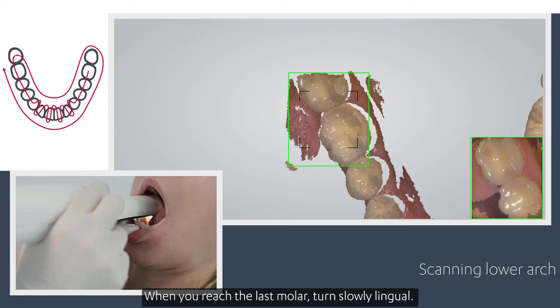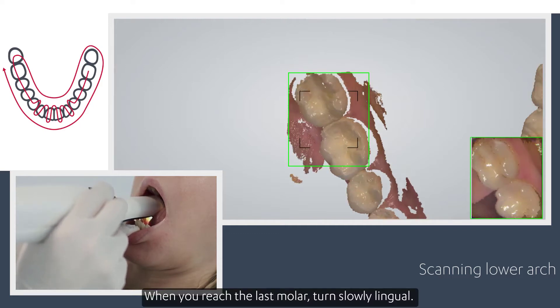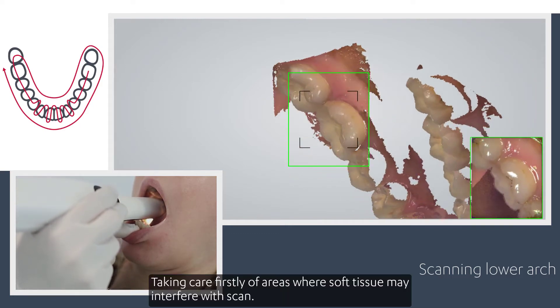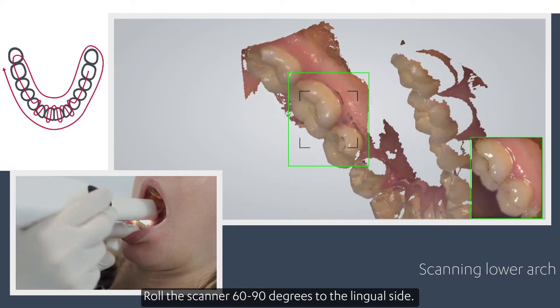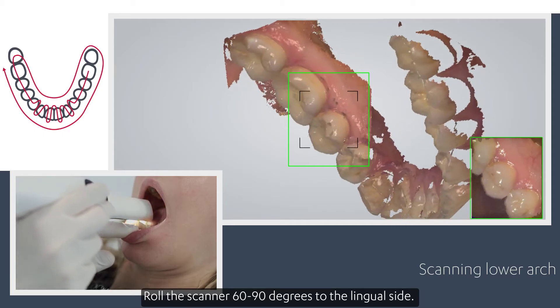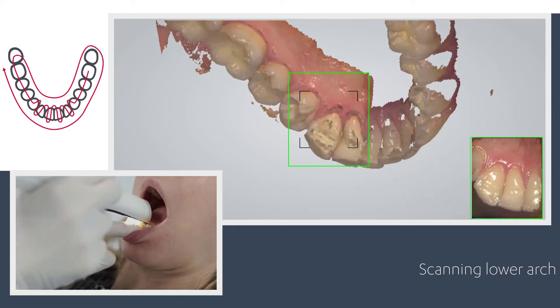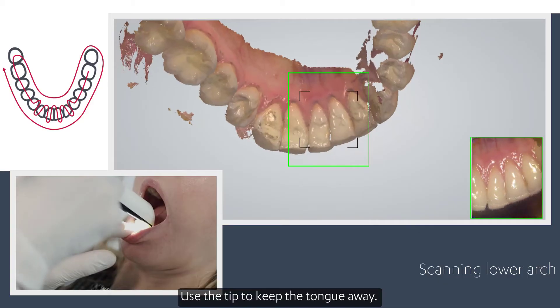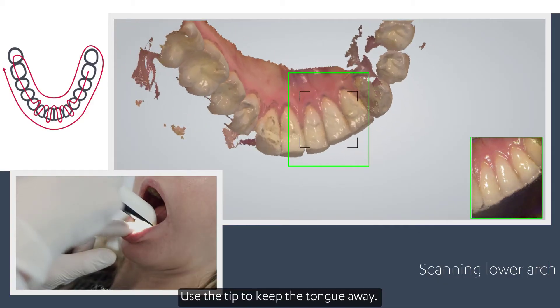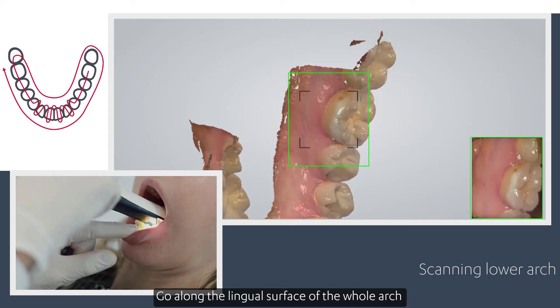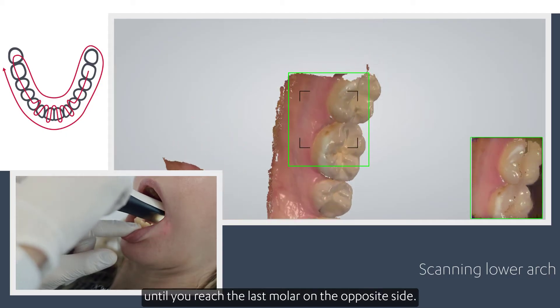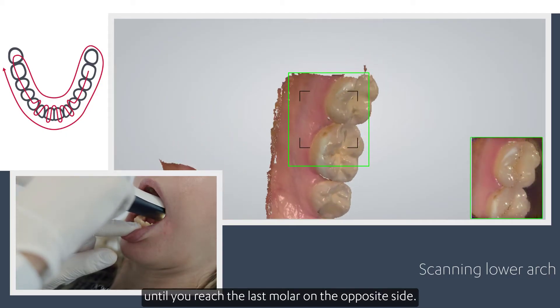When you reach the last molar, turn slowly lingual, taking care firstly of areas where soft tissue may interfere with the scan. Roll the scanner 60 to 90 degrees to the lingual side. Use the tip to keep the tongue away. Go along the lingual surface of the whole arch until you reach the last molar on the opposite side.